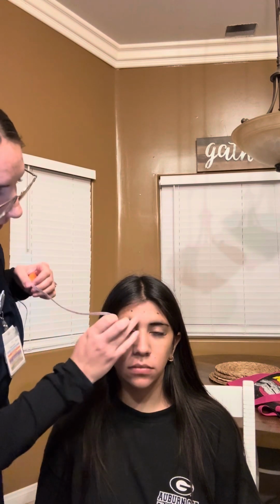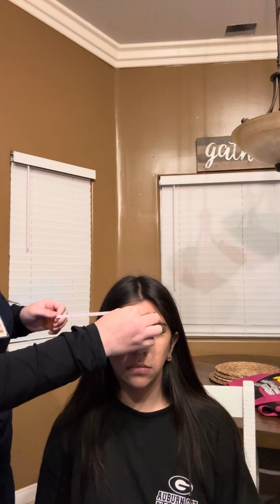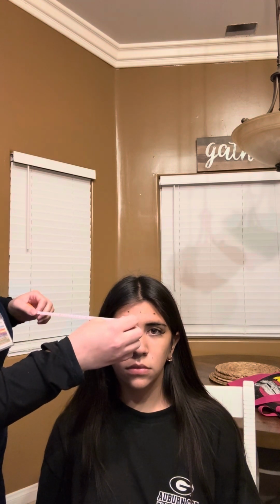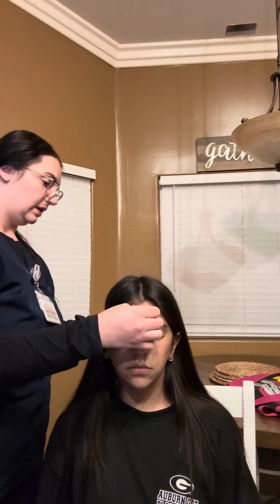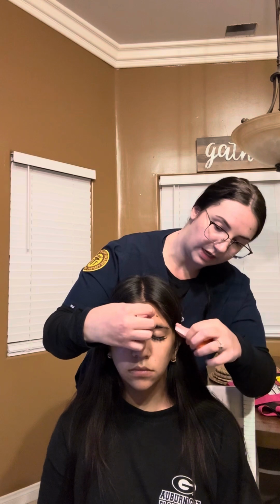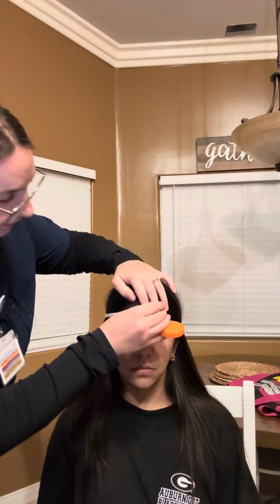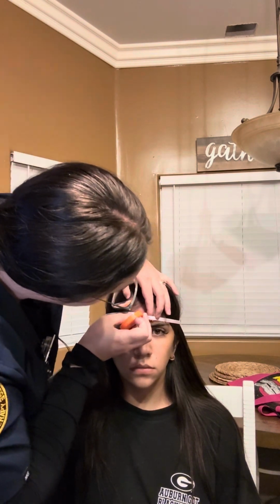For the circumference, we get from the FPZ at 0 centimeters, and then wrap around to T4, the occipital, so the OZ, back to the T3, and then back around, which I got 54.5 the first time we did it.